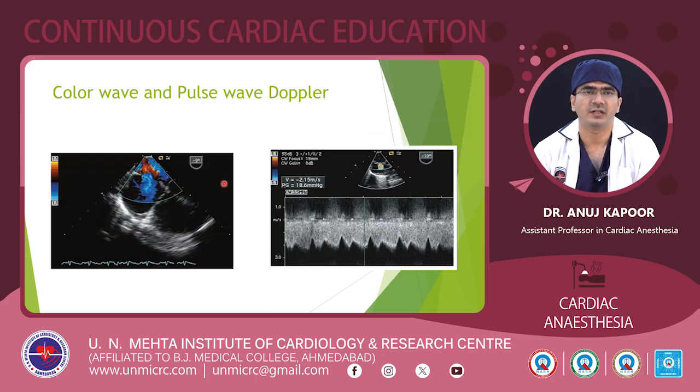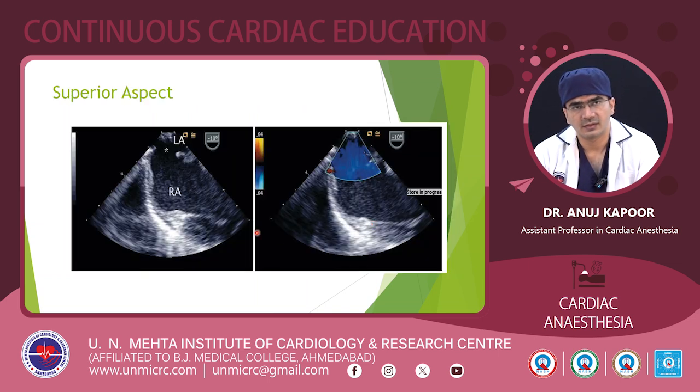For the evaluation of the defect, we will first of all use the color Doppler. We will put a color Doppler there, and we will see the direction of the flow. What we already know is the flow is blue away and red towards. So we'll have to assess the direction of the flow. It will help us to know the pulmonary and systemic pressures, and we can also do a spectral Doppler for that, and we can assess the direction of the flow and the quantity of the flow that is occurring. Then after doing the spectral Doppler, we will now proceed to evaluate the superior aspect of the ASD.